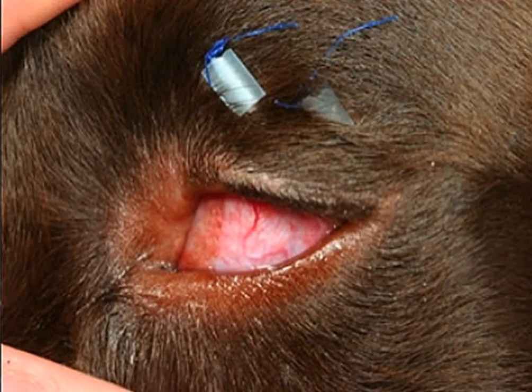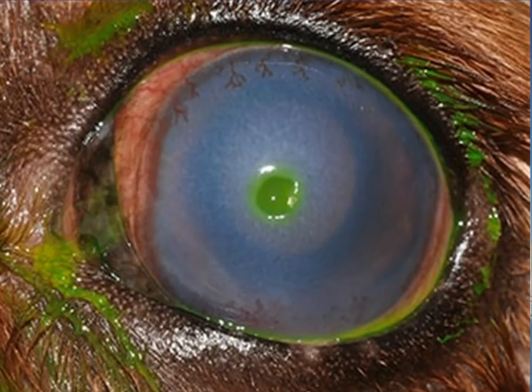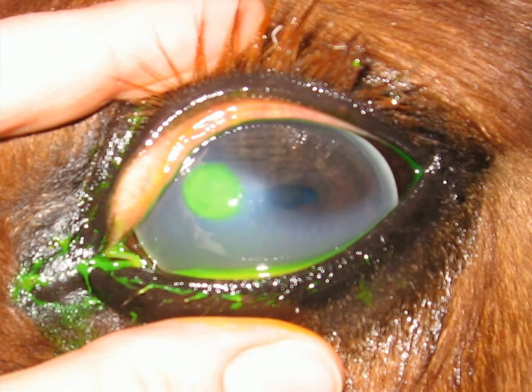They are tied after pulling the eyelid to cover the cornea to its limit. The tie here is not like a surgical knot — it is formed in a manner that it can be untied daily to examine the ulcer. This permits supporting of the ulcer, keeping it warm to stimulate enzymatic action to initiate proper healing, and supplying the ulcer with a large amount of lymphocytes.